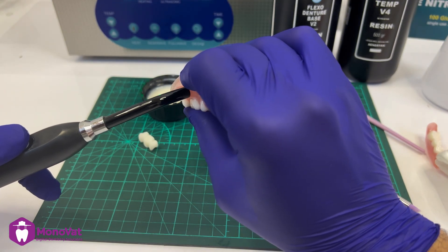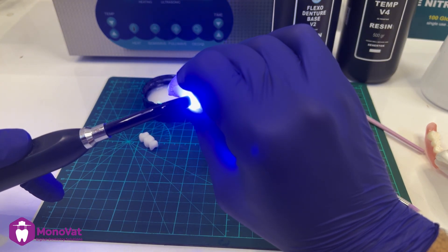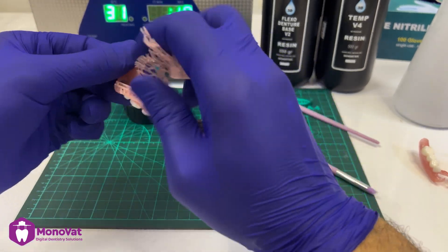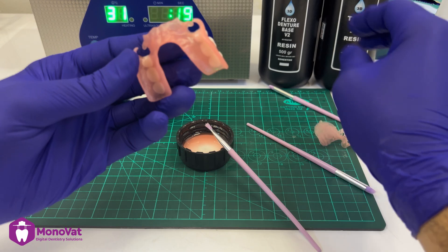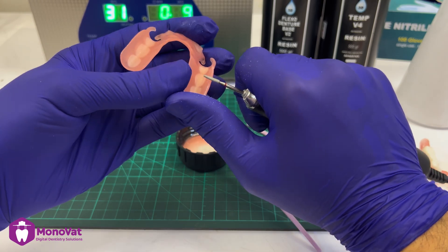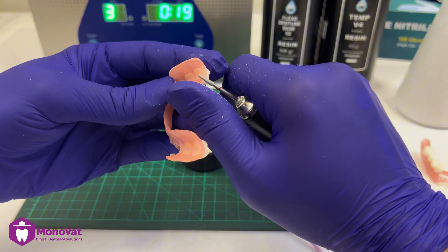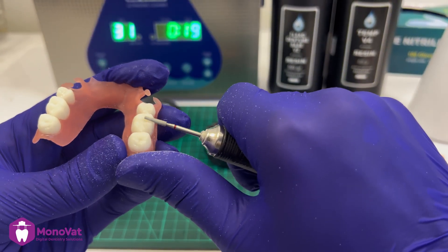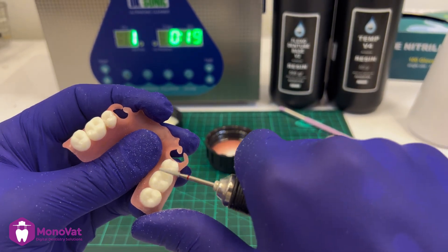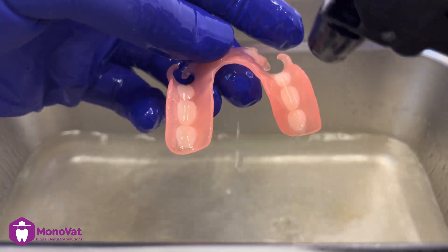Then do the same process for all teeth. After that, we can remove the support from the denture and smooth the edges using an electric handpiece, but try to avoid the inner surface in order not to affect the occlusion. For the teeth, you can also finish and refine some areas.